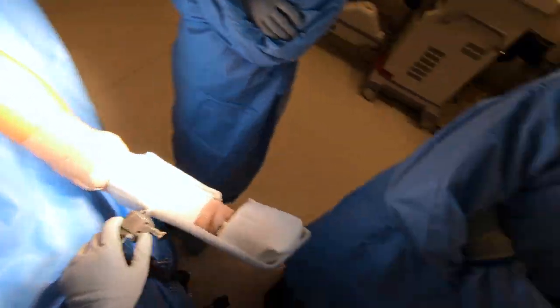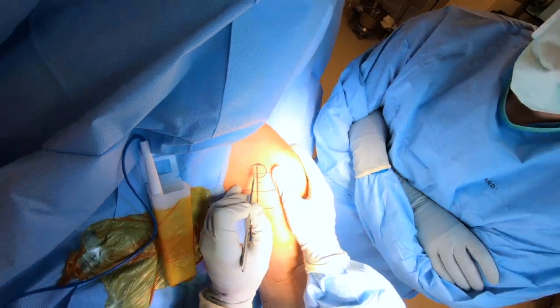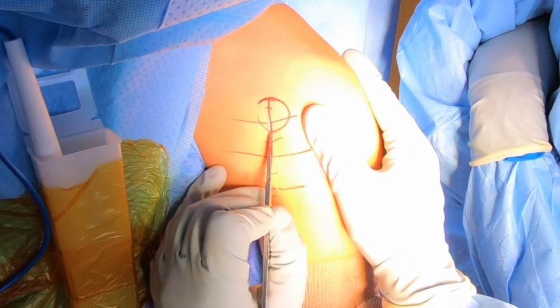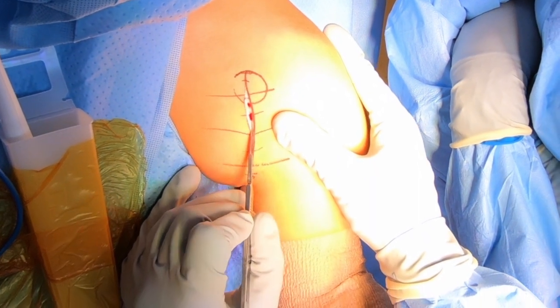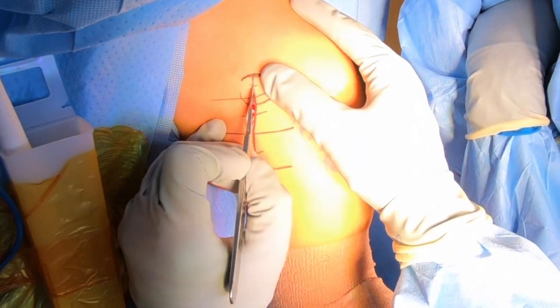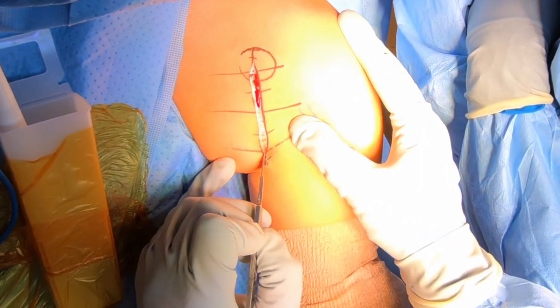The patient is positioned in a seated position for this procedure. You can see the arm out to the side. We'll make our incision here that's about three to four inches long in the front of the shoulder, and this incision will provide us with plenty of exposure. It tends to be a small incision and tends to heal with quite a cosmetic appearance and doesn't tend to cause a big scar.